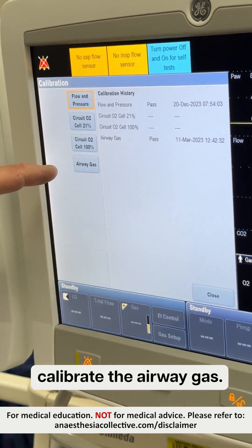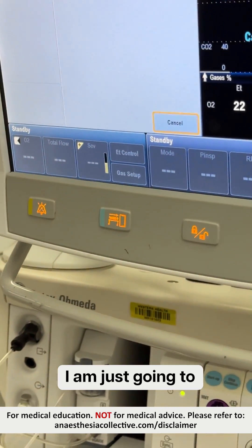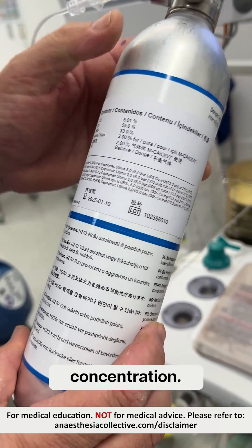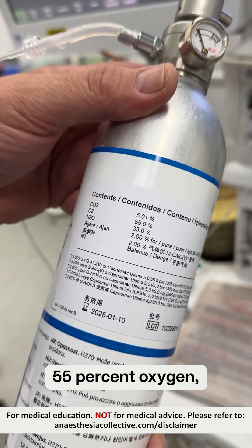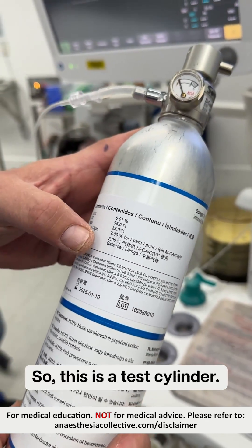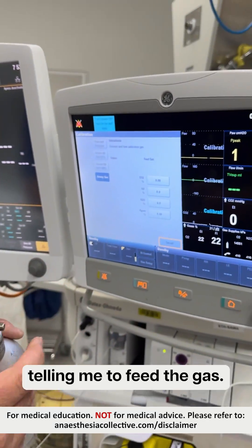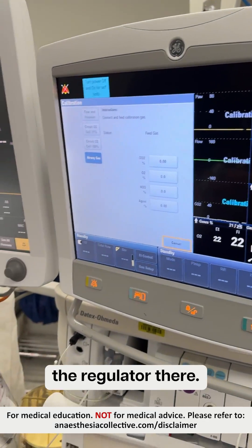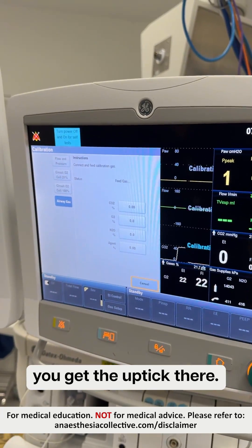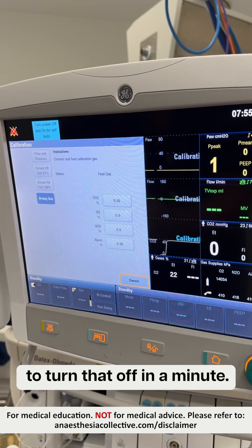The next thing we're going to do is calibrate the airway gas. So I'm going to connect that up to our test cylinder. It's got a mixture of gases and it tells you the concentration. It's CO2, oxygen, nitrous and agent as well. It's pre-calibrated — it's got exactly the right combination. So it's now telling me to feed the gas, so I'll just flick the regulator there. You'll see on the waveform you'll see that you get the uptick there. The gas is feeding for about five seconds or so.